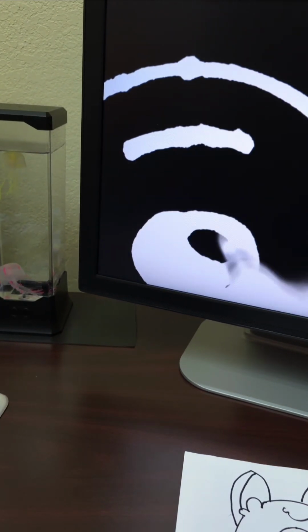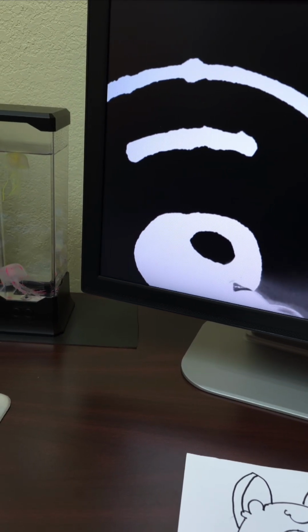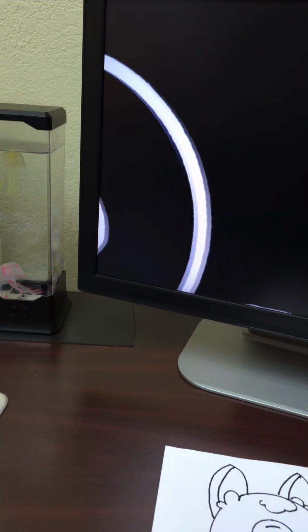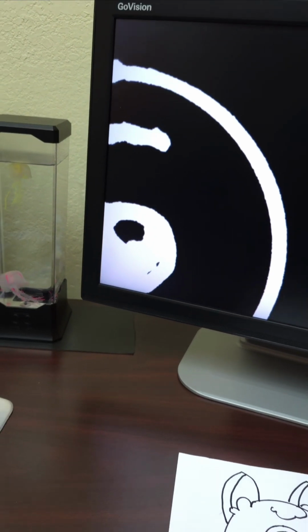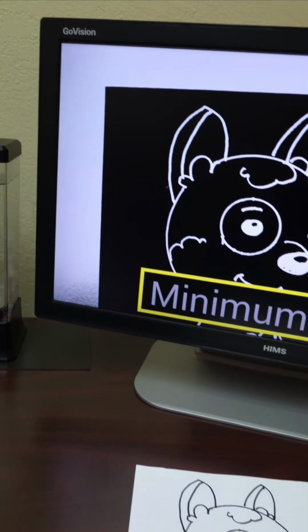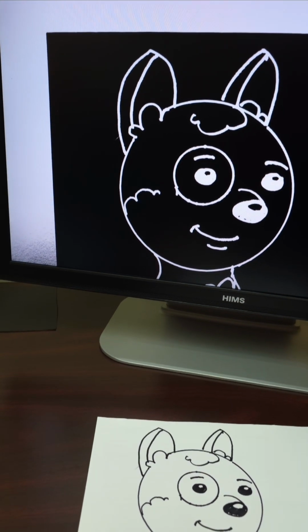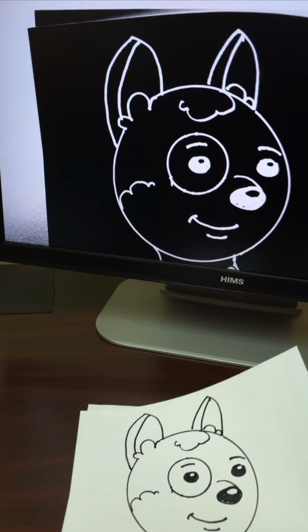And this one's a little bigger, which is okay because it's closer to us, but we're gonna just maybe add a little bit. Okay. I just made it a little smaller, but that should be a little more uniform now. I'm gonna put my pen down. I'm gonna zoom out. Okay. Now I can't really see the details that I did, but you can probably tell that it looks a little bit better, right? So I'm gonna remove this picture.